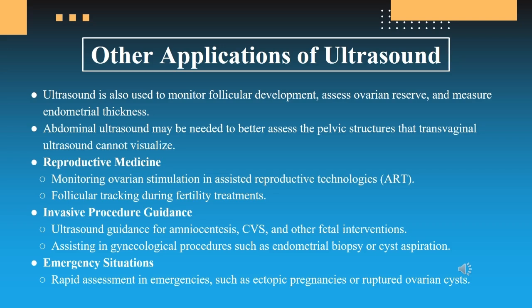In reproductive medicine, it helps with monitoring ovarian stimulation and assisted reproductive technologies. It helps with follicular tracking during fertility treatments, and helps guide invasive procedures like amniocentesis, CVS or chorionic villus sampling, and other fetal interventions.